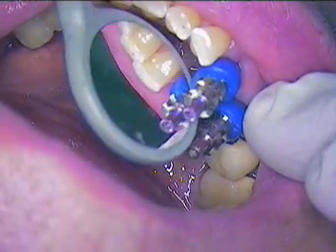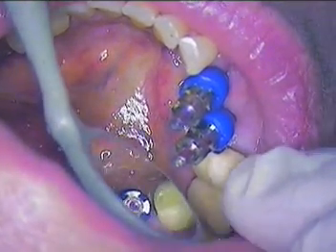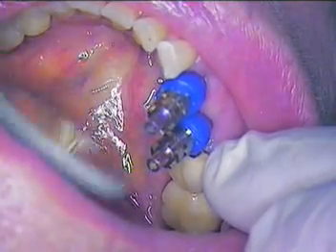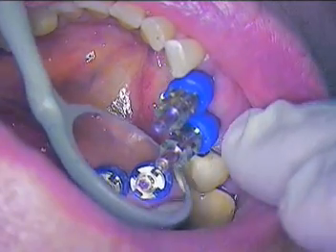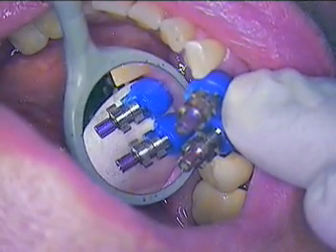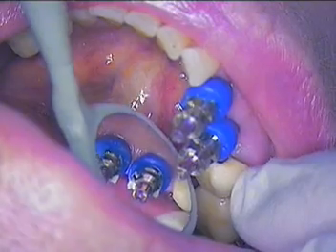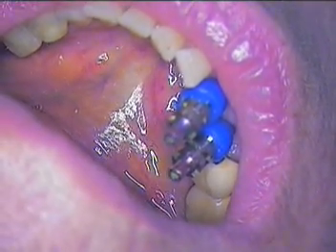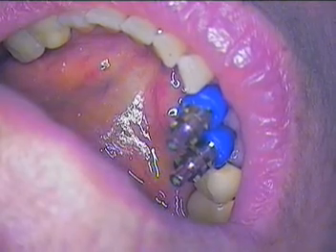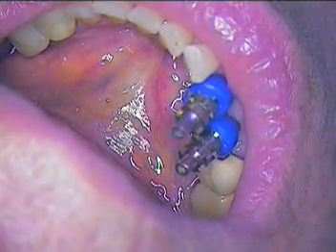I'm going to check to make sure we have our contacts aligned. We do want to check the contact on this adjacent crown. This was a three-toothed bridge that got sectioned at the mesial of tooth number 29, so we had a pontic space and an anterior abutment space. This looks very good — I might disk that contact slightly first, and then we'll move forward to the impression phase. I'll do this disking, and if we have time remaining, we'll take our impression; otherwise I'll put it on the next segment.